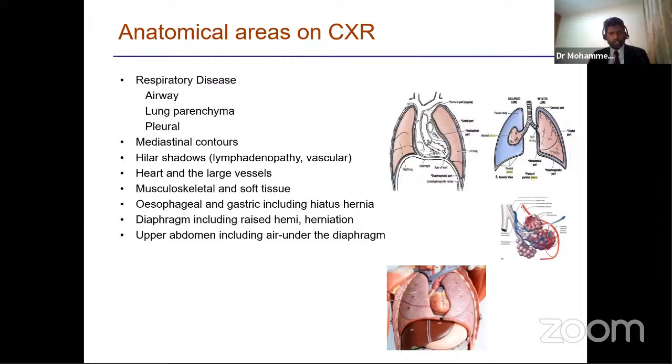Many a times we have seen patients going into a surgical assessment unit with a lower chest pain, and thinking that it could be something to do with the liver, or it could be cholangitis, or it could be coming from the subdiaphragmatic area, whereas it was just a right basal pneumonia. And this basically highlights the importance of doing a chest X-ray in anyone presenting with symptoms starting from below the neck, below the mandible going up to the belly button. I would certainly want to have a look at the chest X-ray.